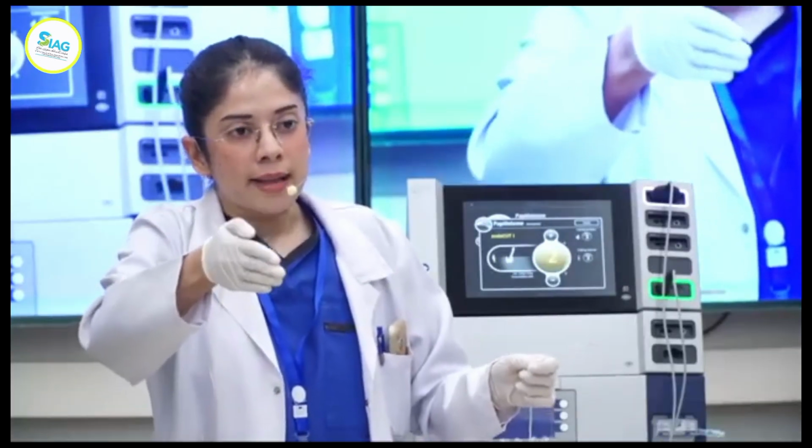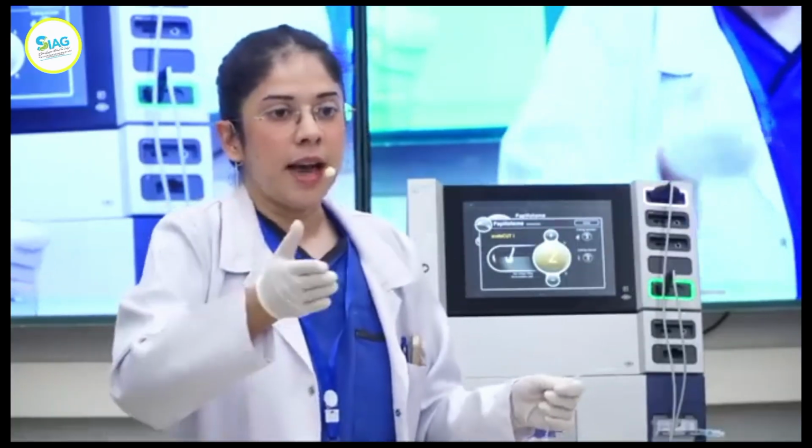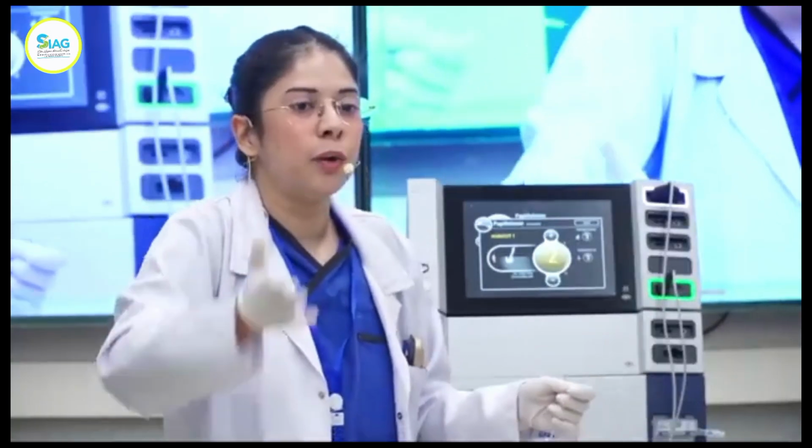Okay? So as I keep cutting, I won't have a continuous slice. I'll have a little bit of time to anticipate what the next move of the sphincterotome will be. People that do pure cut, like Dr. Saad does, he has such good control of his hand. It's not illegal to do pure cut. It's not like the police are going to come get you if you did pure cut. You can do it.